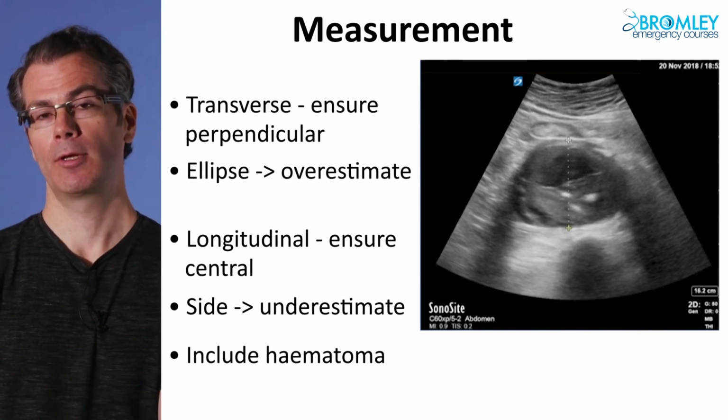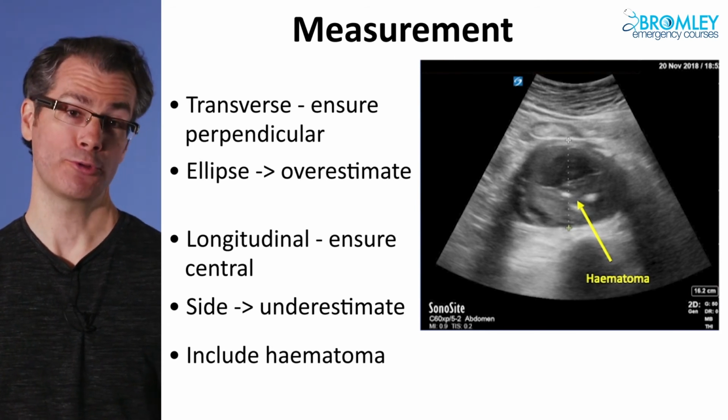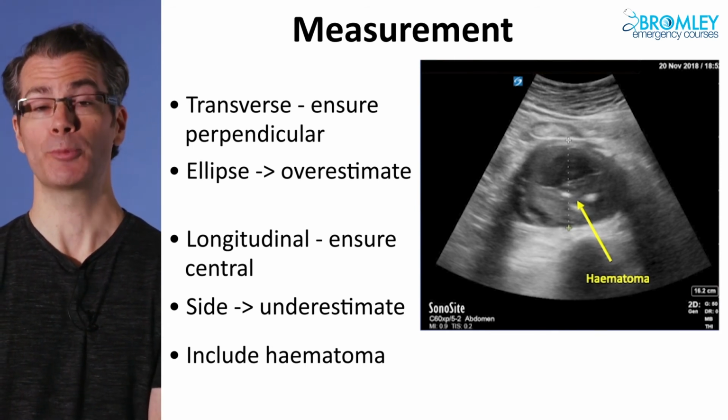So in this image, there is a large hematoma, and you can see if we did not include that in the measurement, we would grossly underestimate the size of the AAA.